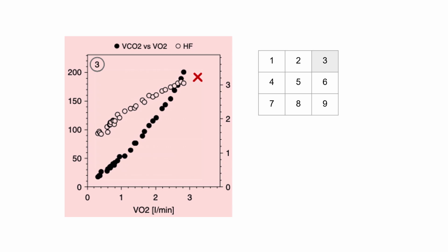And this is one of the ways that we can look to see if this is a generalized impairment in heart rate response or a submaximal effort. So to go over that again, here we have someone who is relatively deconditioned compared to normal because you can see they're above the predicted maximal heart rate trajectory. And here is someone who is below, who has a shallower line, who is more conditioned, who is more fit.